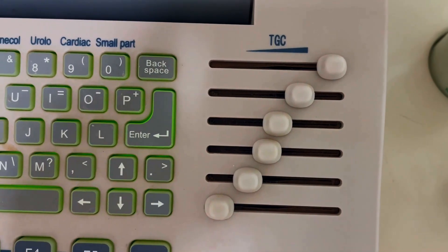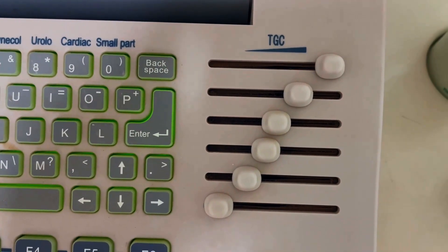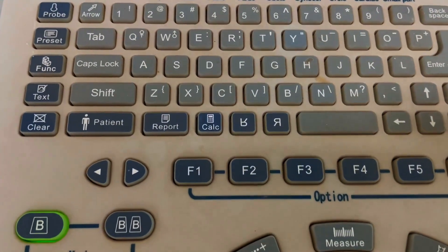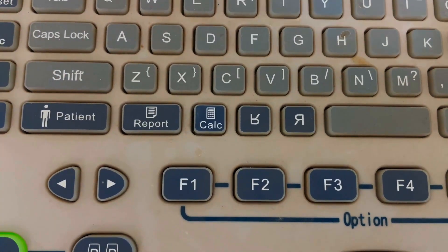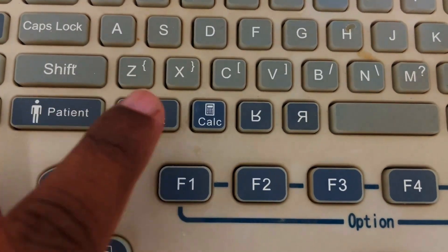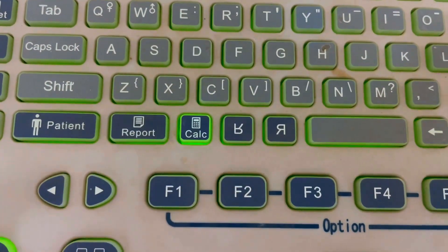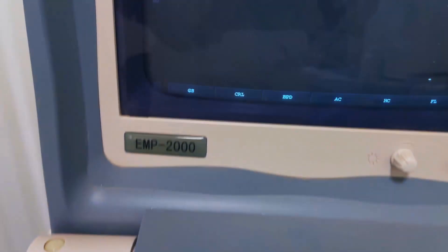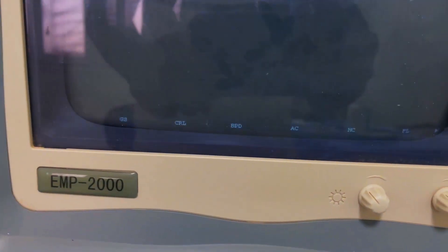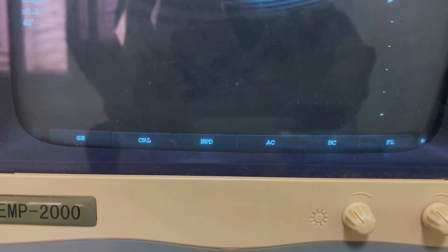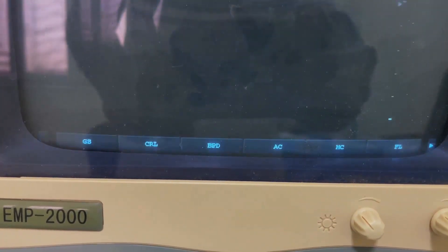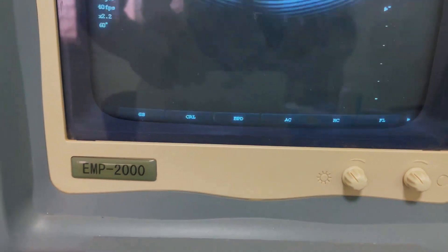This one is the settings panel. If you want to measure any type of gynecological or obstetrical parameters, just press the calculation button. This will show you different types of parameters such as gestational sac, CRL, BPD, AC, FL, and more.